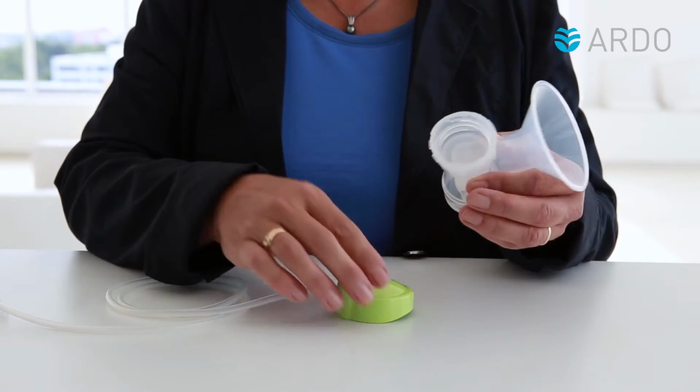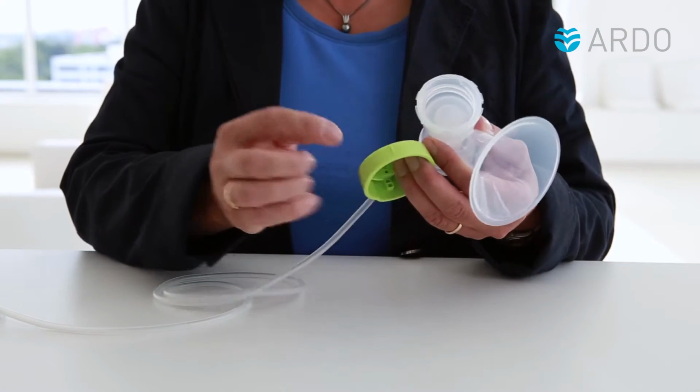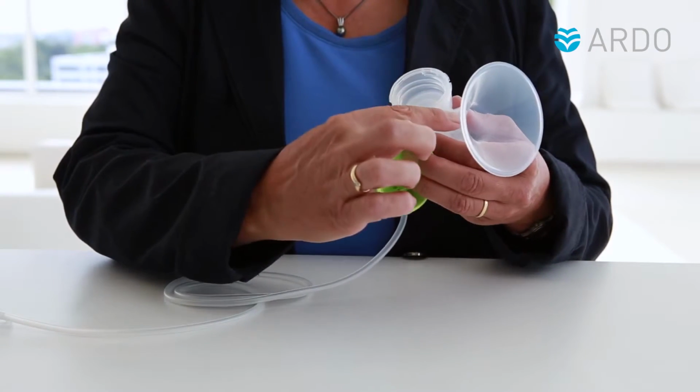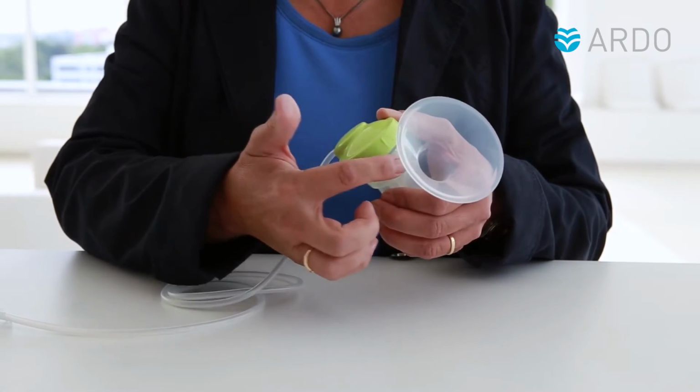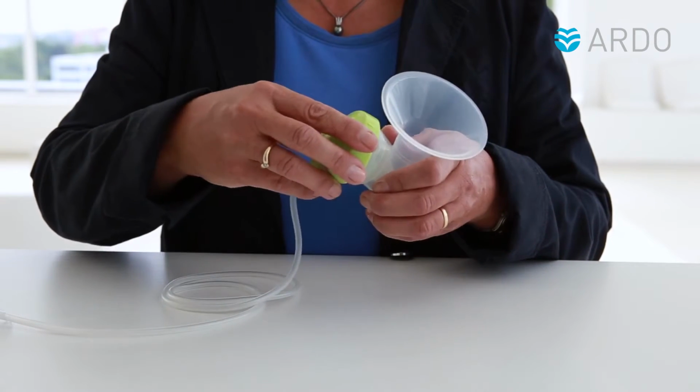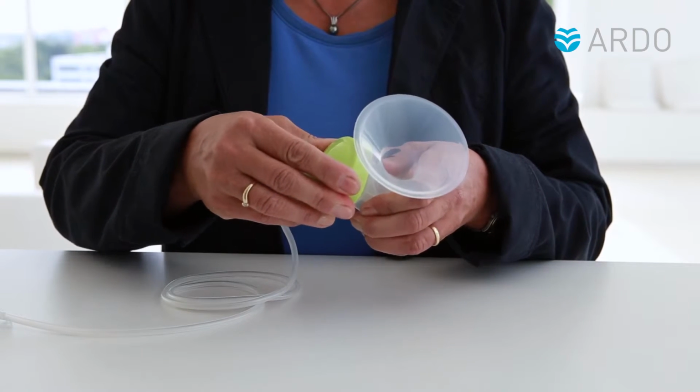When attaching the green lid, please position the line markings on the cap and the breast shell so that they line up. Then gently turn the cap approximately half a centimetre to the right.